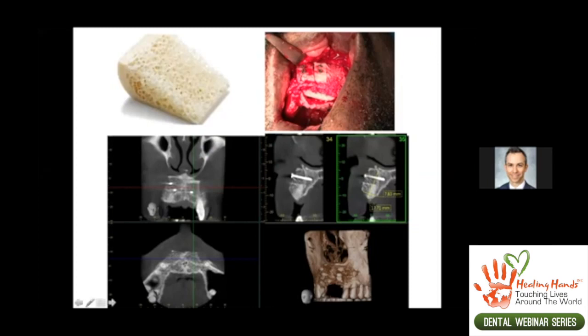I make sure to place these bone grafts a little bit more apical to the crest, to decrease the chance of dehiscence. And I shape these grafts until they adapt very, very intimately to the underlying bone. We don't want any gaps or spaces between the bone graft and the recipient site. This is very important, I think, and I typically use some pretty long screws.